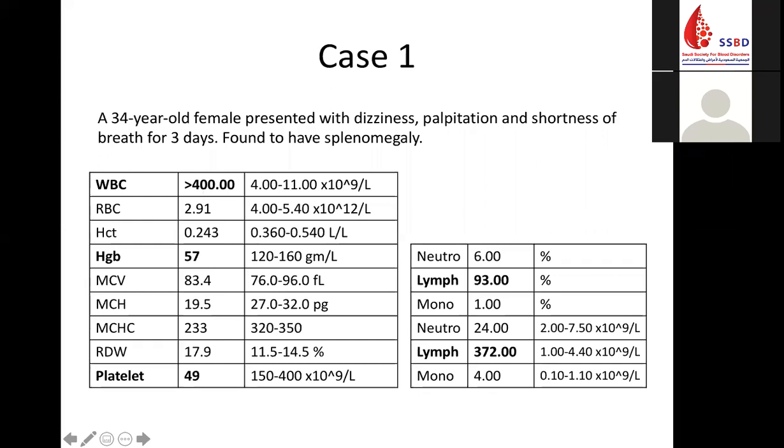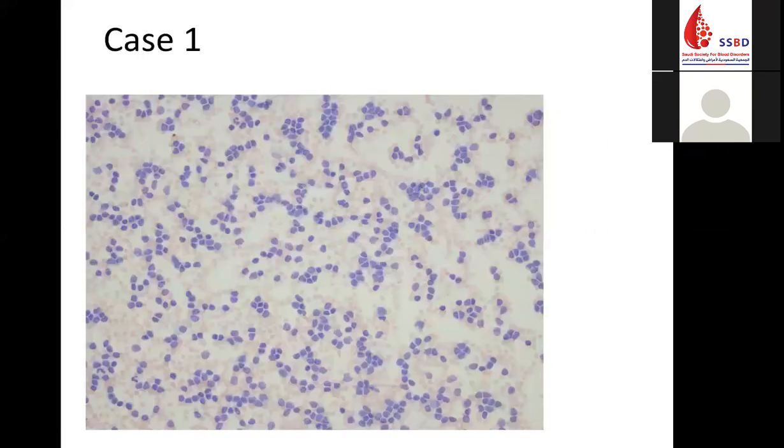And definitely you will go to your peripheral blood smear. And this is the peripheral blood smear, confirming the hyperleukocytosis. You have a monotonous presentation of the cells. They are almost similar to each other, all the white blood cells. And we also have basket cells or smudge cells, as Dr. Haytham explained yesterday, many fragmented cells in between. And we have all these monotonous cells.